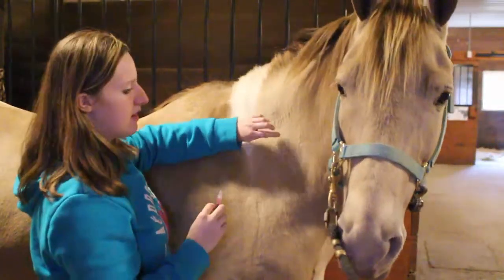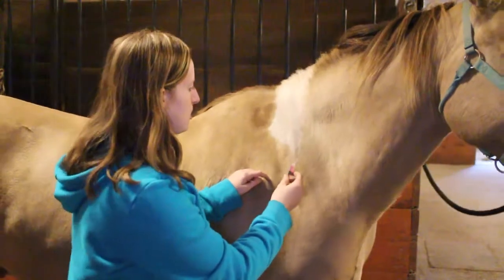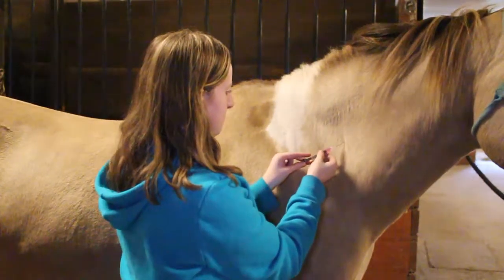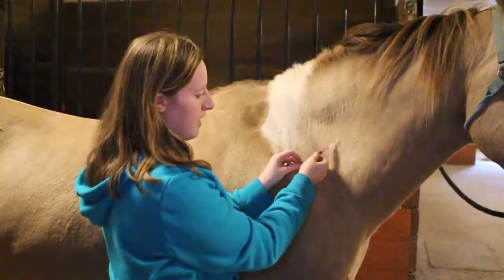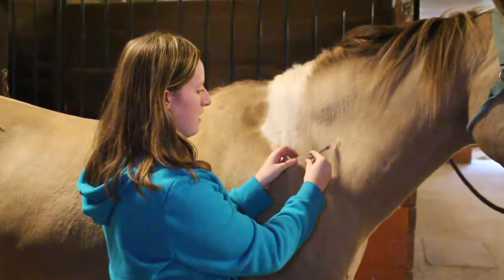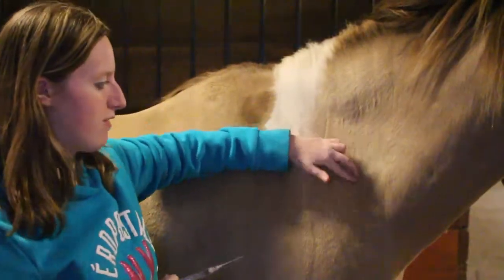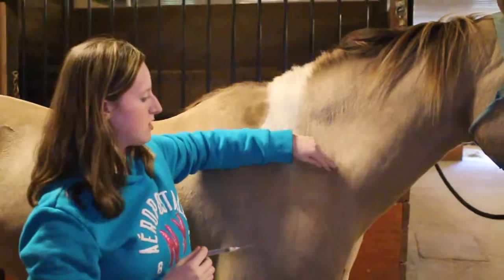I'm going to go right in the center of the triangle. When I inject it, I want to push firmly but not like I'm stabbing him. Then you're going to pull back, make sure there's no blood, and then inject your horse. I always go kind of slow. And when you pull it out, I always rub the spot for a moment just to make sure there are no lumps after the shot.